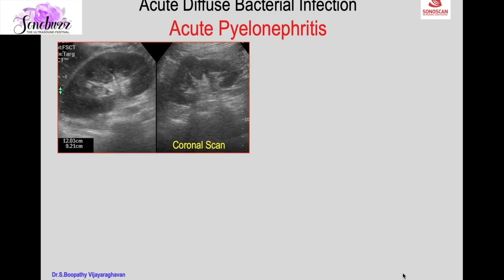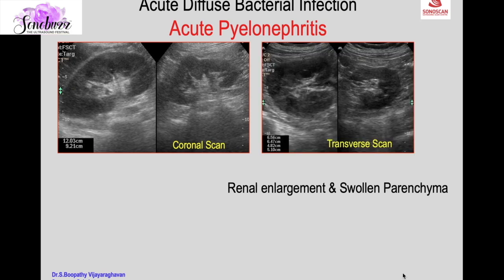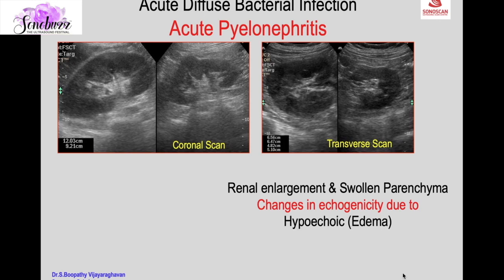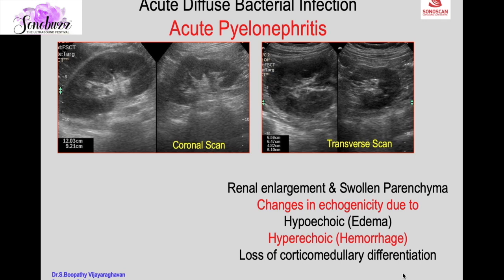This is a coronal scan in a case of right flank pain and fever. The left kidney is normal whereas the right kidney is enlarged. The characteristic feature of acute pyelonephritis is renal enlargement and swollen parenchyma, well appreciated in the transverse scan. Changes in echogenicity of the renal parenchyma may be hypoechoic due to edema or hyperechoic due to associated hemorrhage. There is loss of corticomedullary differentiation and loss of renal sinus fat due to parenchymal edema compressing the central echogenic area.